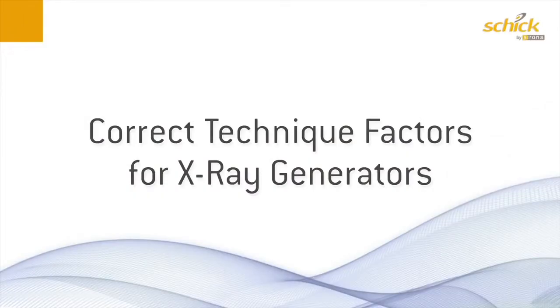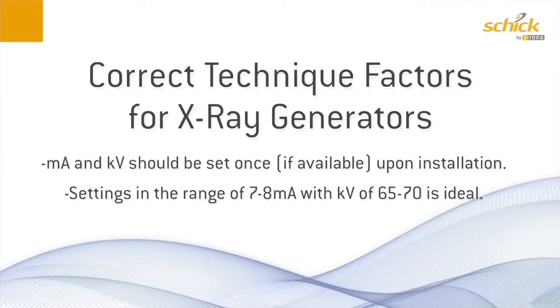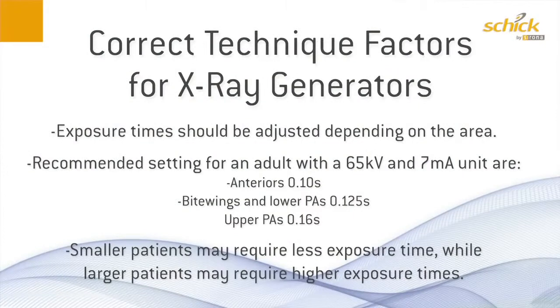There are three technique factors in making sure to get consistent diagnostic radiographs: barriers and holders, generator settings, and sensor placement. Let's talk about our generator settings. KVP and MA should be set to a constant. It should be set upon installation of your sensors and left. Our exposure time should be adjusted according to our patient size and the area of the mouth that we're exposing. For instance, upper molars require a higher dose.